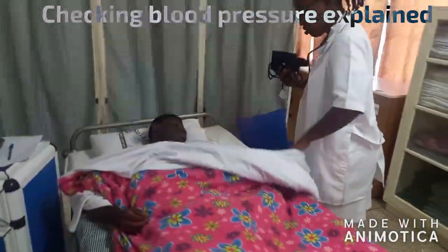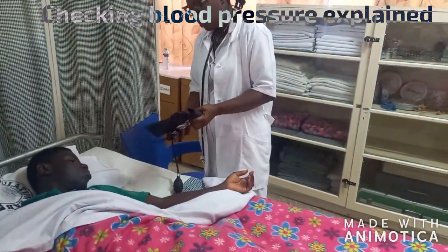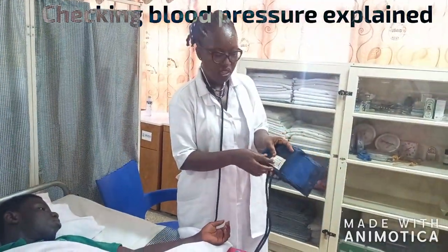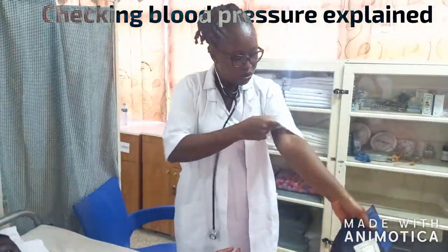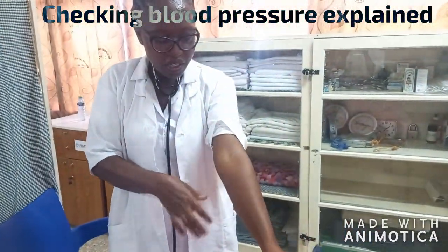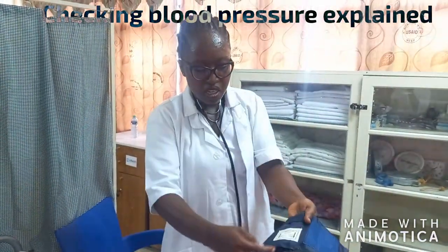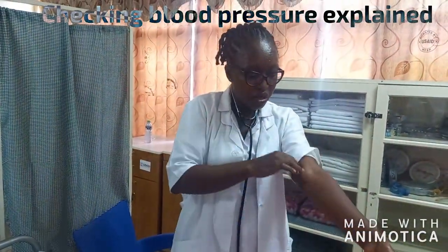I'll use this around your arm. So there's the cuff. For the baby, this is the cuff. And there's a bulb here that will balloon when you inflate it. You see these arrows? They are supposed to appear here on this side of the patient's arm. This is the antecubital fossa, and that is where the arrows should appear while you apply the cuff. So you can't apply it with the arrows here — they should always be here.